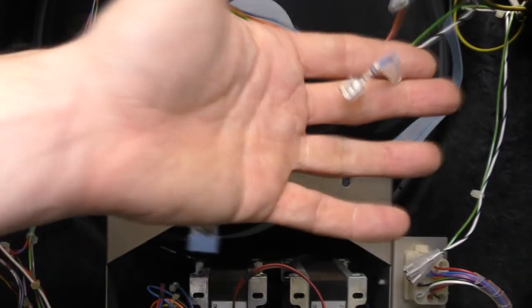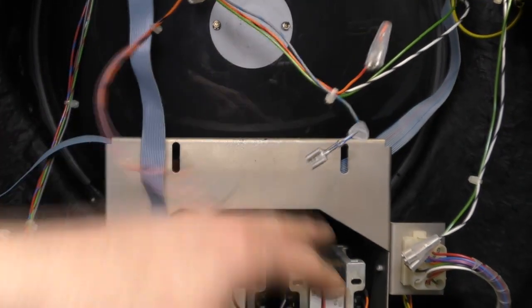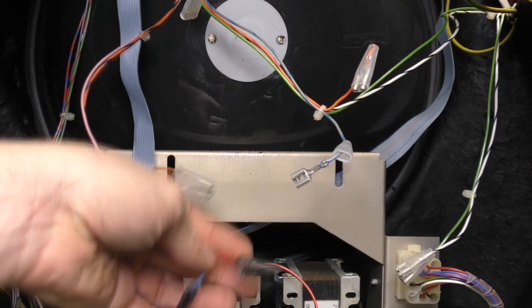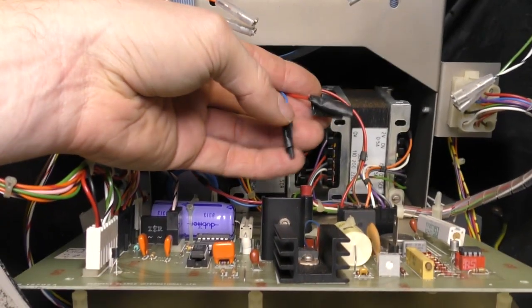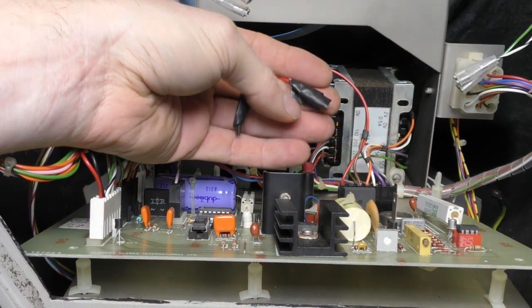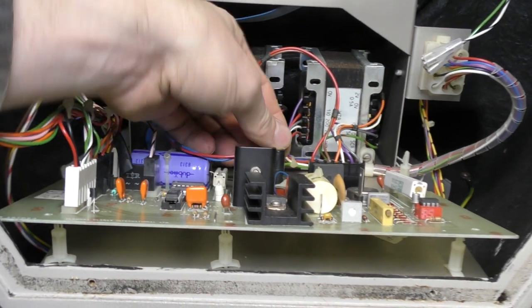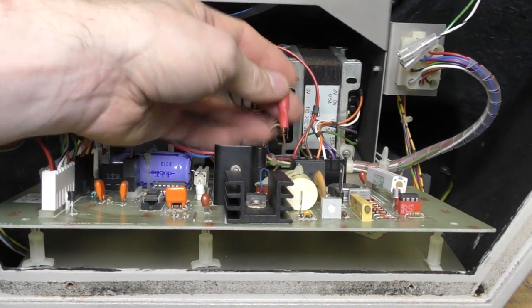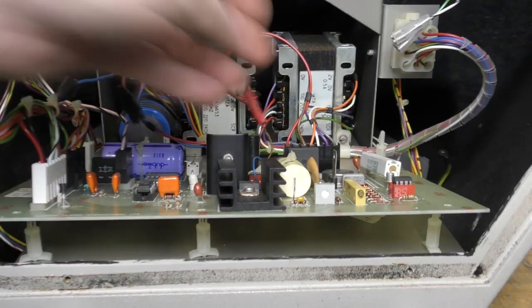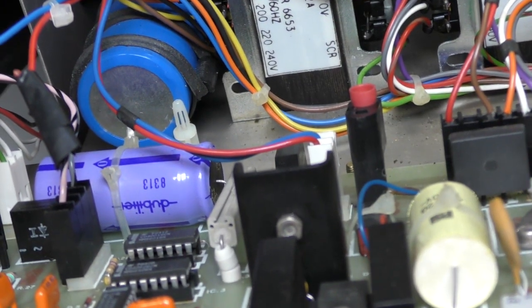And then there's a number of random spade connectors, but then there's the high voltage connection from the tube to the base. It didn't have any connector at all, and it looks like at some point in its life these have been cut and just fixed with insulating tape, and I suspect that might be where those sparks I saw were coming from. The high voltage cable just goes down onto this spade connector, and there's this plastic holder that holds it in place. It's all just a real bit of a bodge.